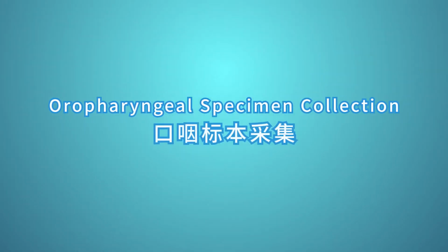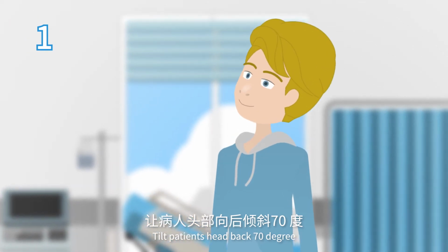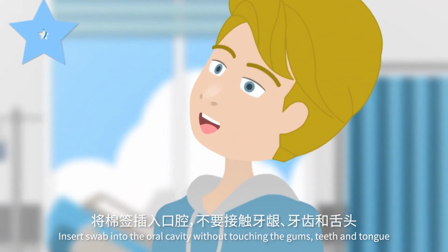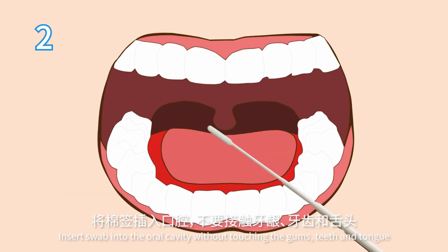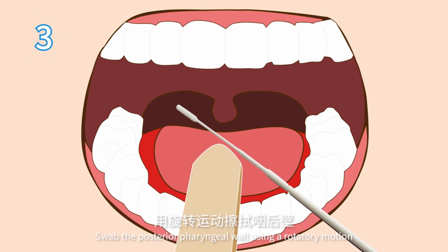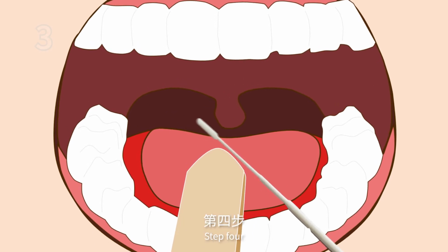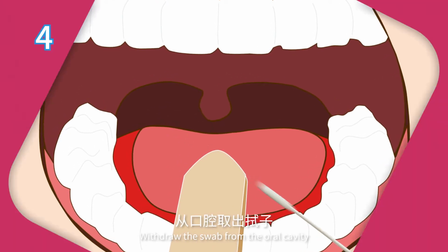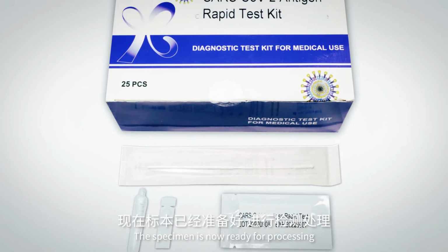Oropharyngeal specimen collection. Step 1. Tilt patient's head back 70 degrees. Step 2. Insert swab into the oral cavity without touching the gums, teeth, or tongue. A tongue depressor may be used. Step 3. Swab the posterior pharyngeal wall using a rotary motion. Step 4. Withdraw the swab from the oral cavity. The specimen is now ready for processing.